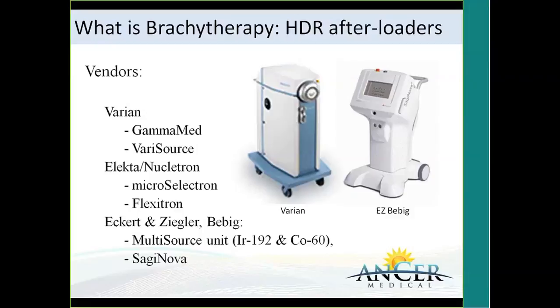And in terms of where it would be used, I don't think that would be a difference because, remember, these are both high-energy sources, and they both behave pretty much the same. They both follow the inverse square law, which describes the fall-off. I will show that in the next few slides, describe how the fall-off from the sources is. So okay, great. Clinically, the use is the same. It's just a practical distinction.